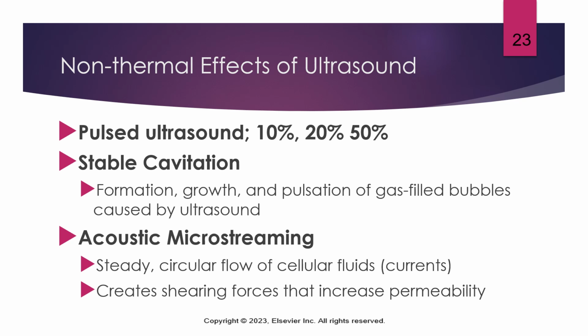Essentially what we're trying to do is increase cellular permeability here. This is going to allow those metabolic waste products to exit the tissue and allows the exchange of new healthy nutrients to enter, which is going to help improve our tissue healing response.